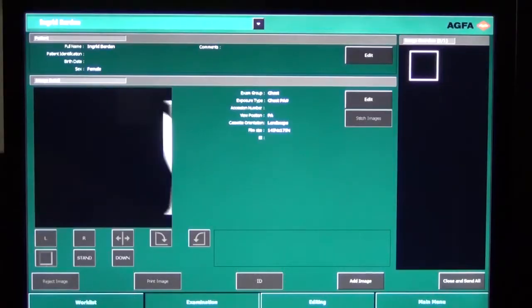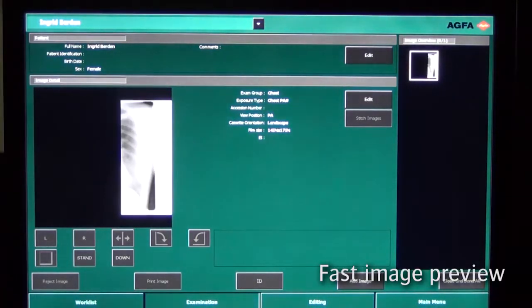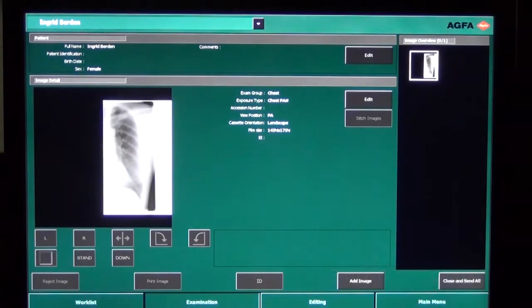While scanning the cassette, the preview image is building up. The white borders that you see are the non-exposed areas as a result of the collimation.